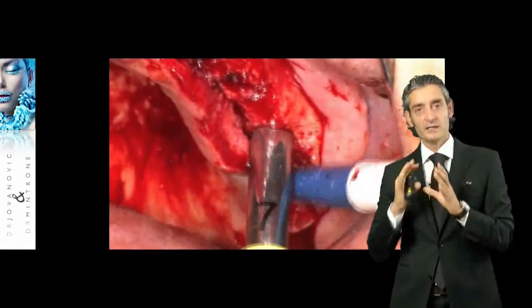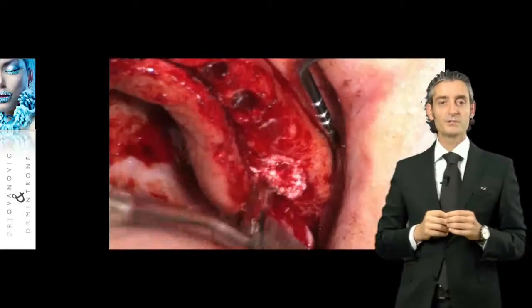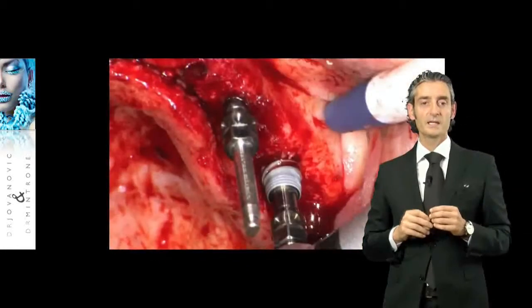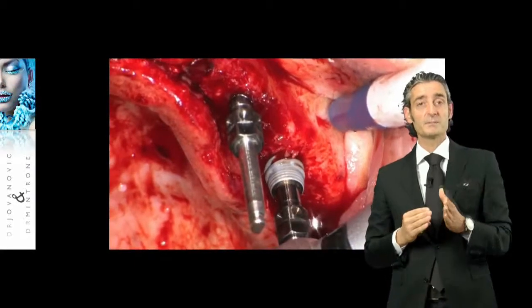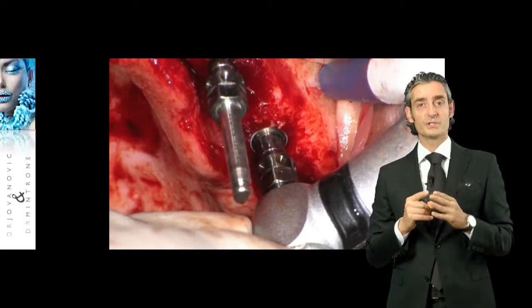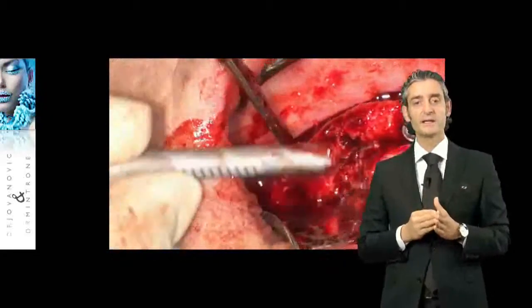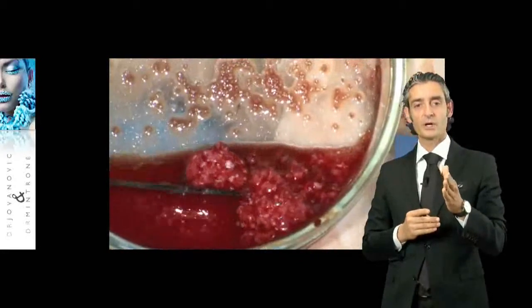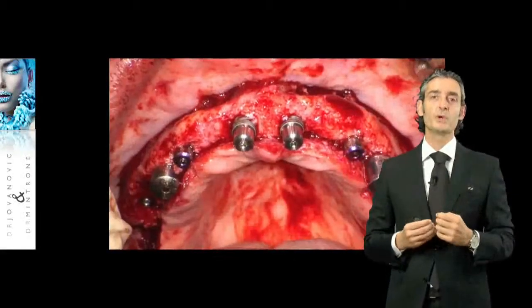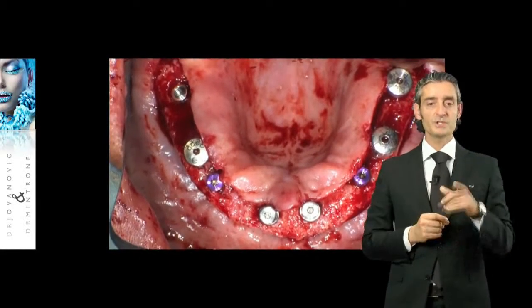in order to have the right space in that position. Now we are finishing in the posterior, as you can see, and for sure the primary stability, as I told you, is really important. This is the reason why we used this kind of aggressive implant, NobelActive, and as you can see we are collecting bone. This is our mix between autogenous bone and xenograft. This is the position.